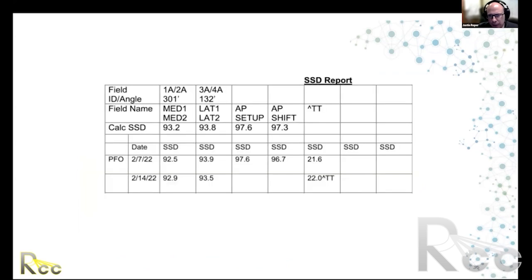It's so important to take good notes at CT simulation that get passed on to the treating therapist. It's also important to take good notes at the time of treatment planning and to send over that communication to the treating therapist. Here is an example of SSDs, which can be measured on the machine with an optical distance indicator or front pointer as confirmation that the patient is in the correct position.